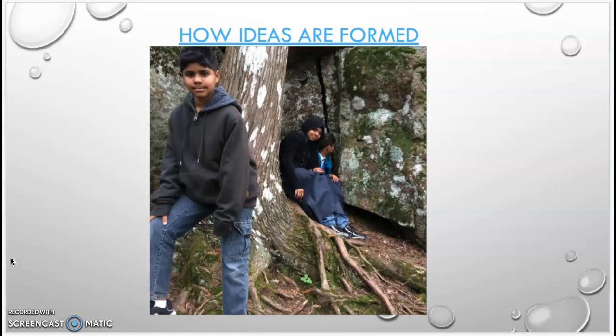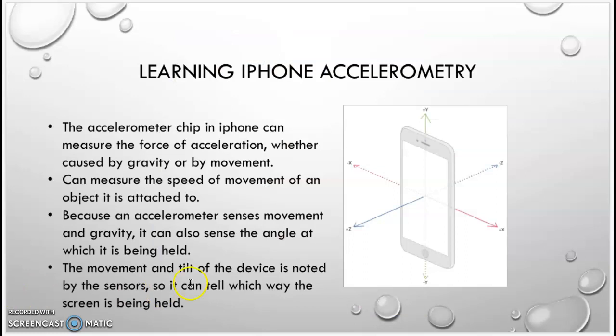So I did some Google search and I found this page where it says that iPhone has an accelerometry chip, and the same chip iPhone uses when it counts our steps, when it changes the iPhone screen from vertical to horizontal direction. It also can tell us whether we are working hard in the OR or we are just sitting in the physician lounge, by counting the number of steps.